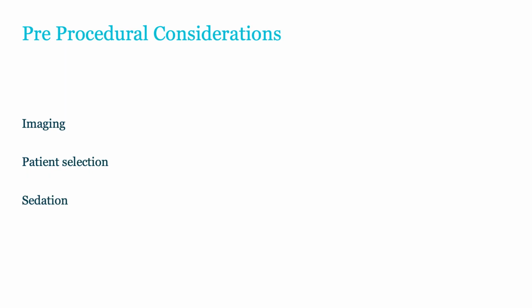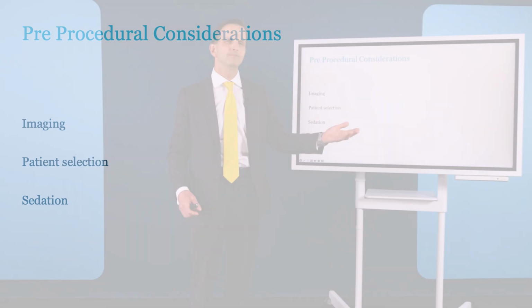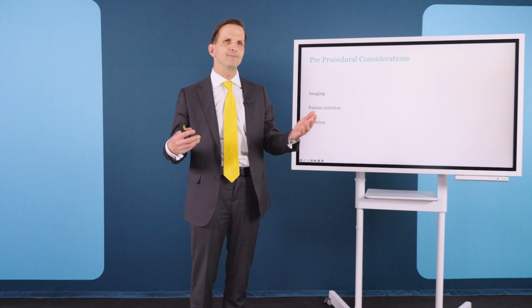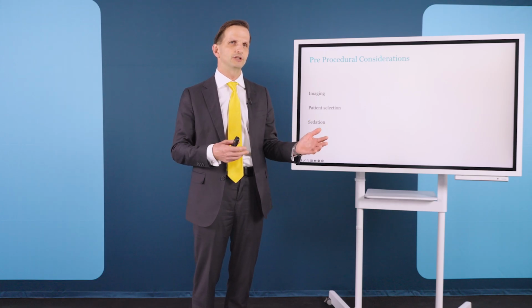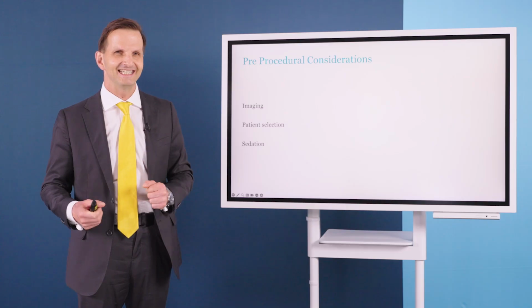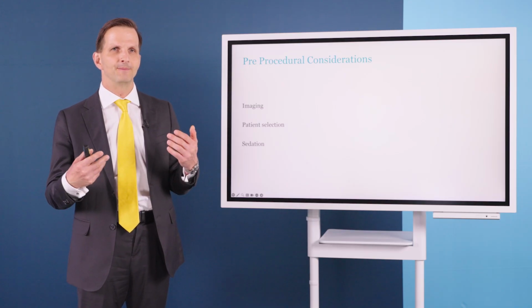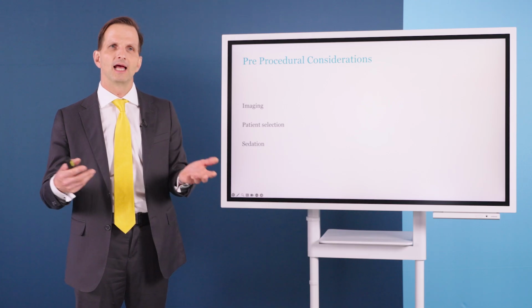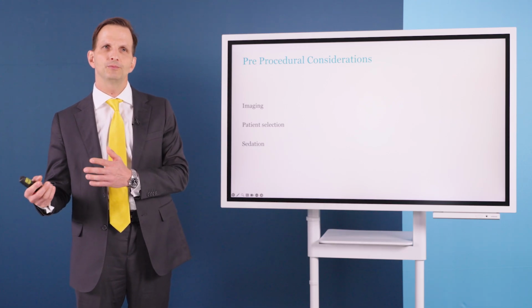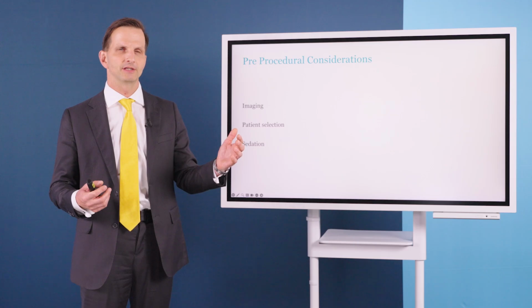So what about imaging? Do you need TE before the procedure? Do you need a CT? I think that's rather a matter of your institutional standard than of the technology. There are centers that use CT or TE for every patient. And some centers like us, we don't perform any pre-procedural imaging.